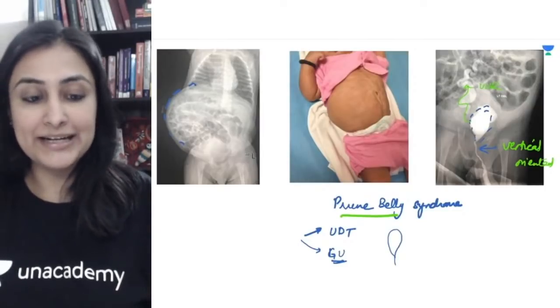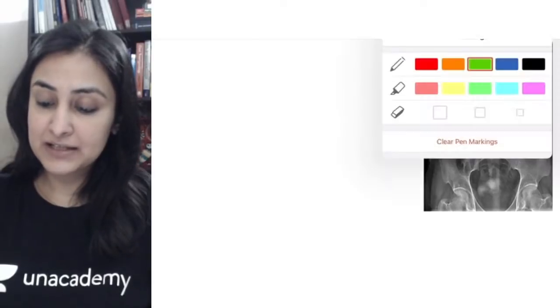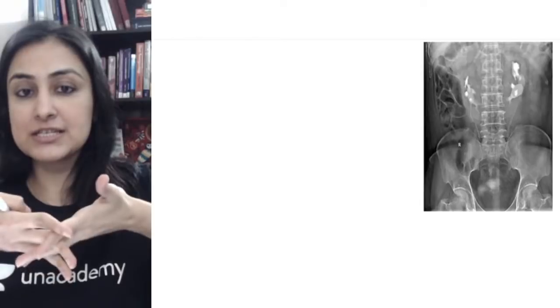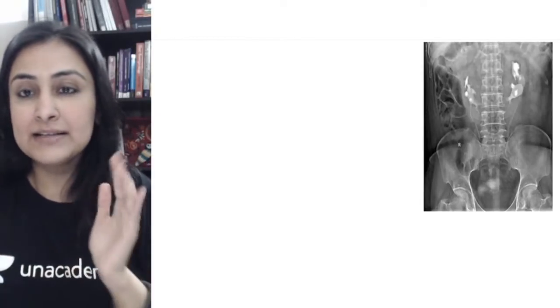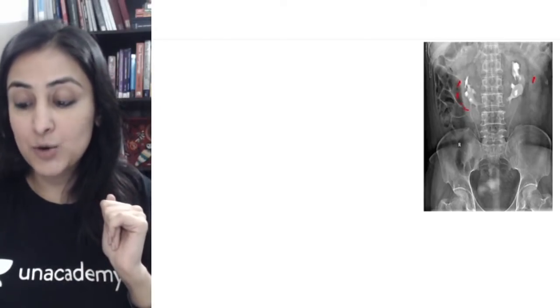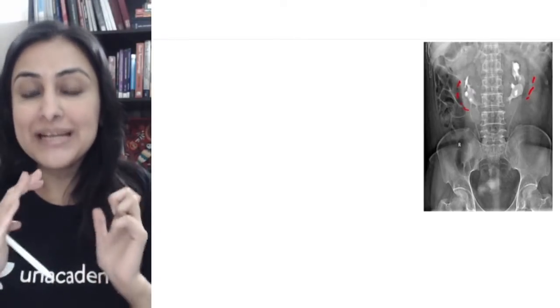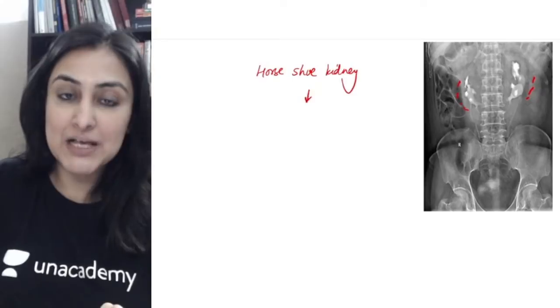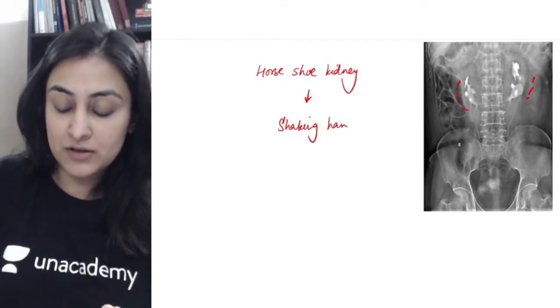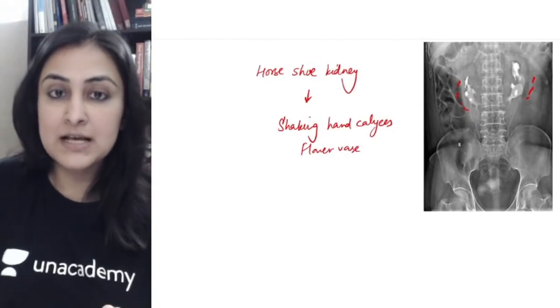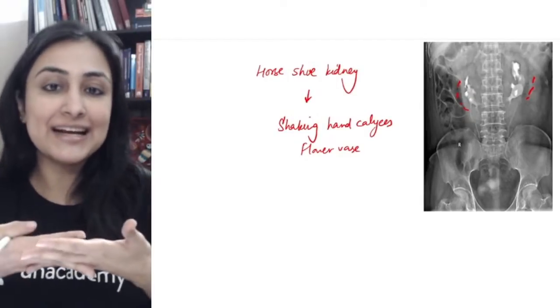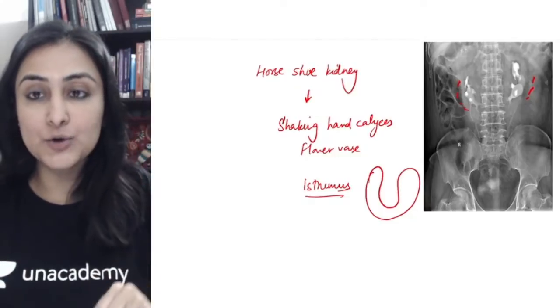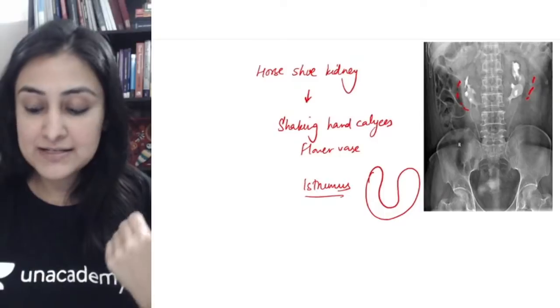Next image — something you can't afford to get wrong. We are seeing that both calices, particularly the inferior pole, are trying to meet — trying to shake hands. The kidneys are oriented inferiorly and malrotated, facing medially toward each other. This is the horseshoe kidney. This sign has been called shaking hand calices or also referred to as a flower vase appearance.